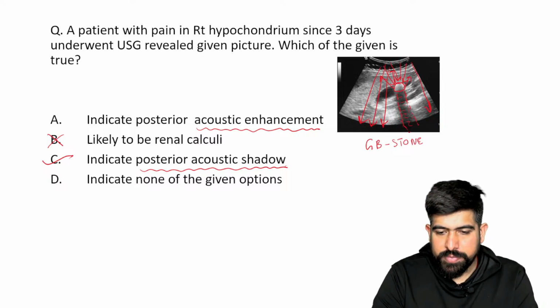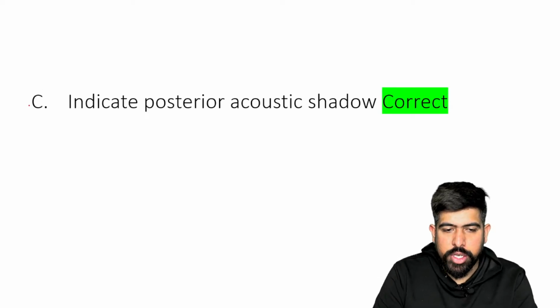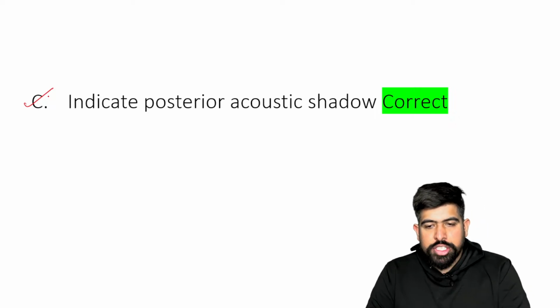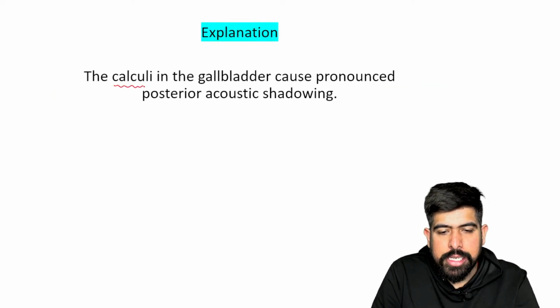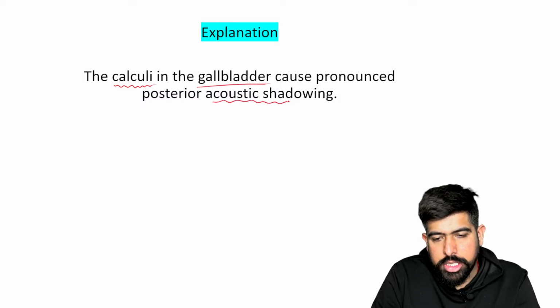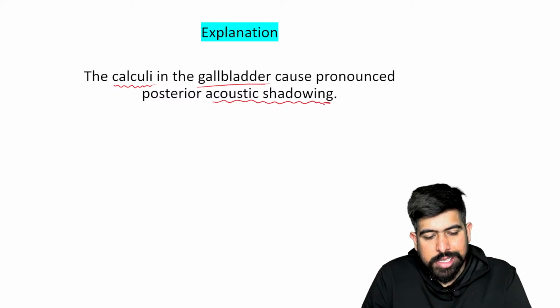The answer is indicating the posterior acoustic shadow. And yes, the calculi in the gallbladder is causing the posterior acoustic shadow, right? So this is the calculi.